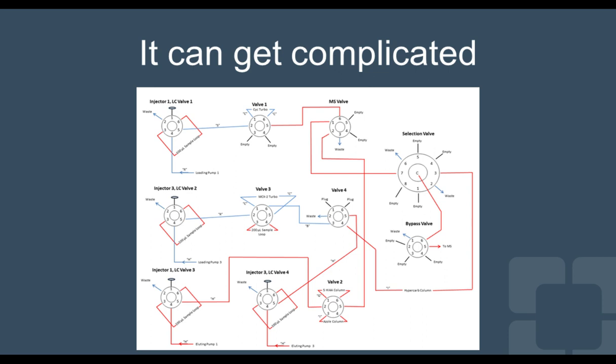Not to go through this, but just an example of one pump system in our laboratory, where you can see there's multiple injectors, multiple switching valves, multiple columns on different systems on this LC to achieve different methods that you need. So it can get much more complicated than the simple depiction.